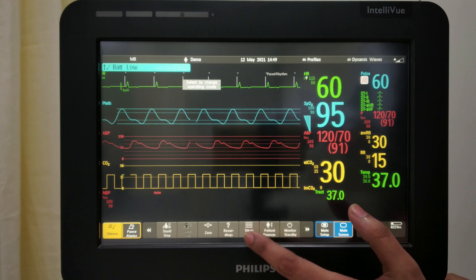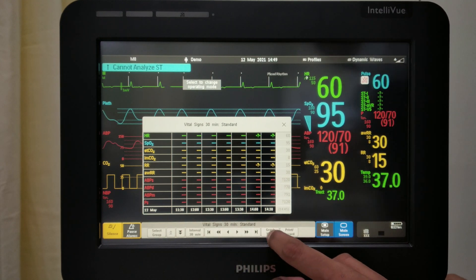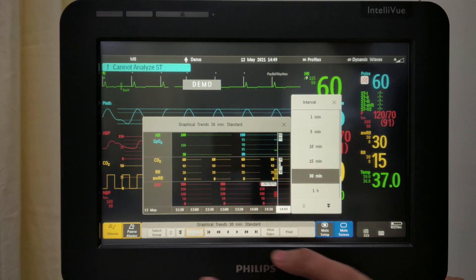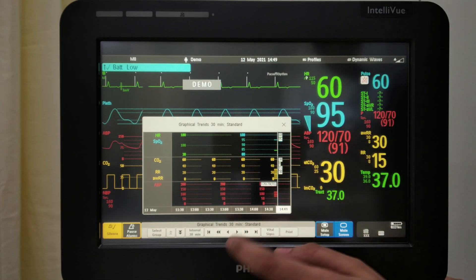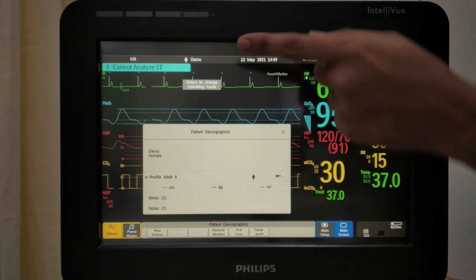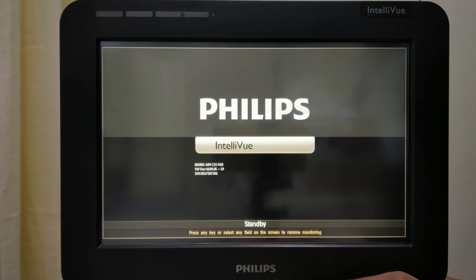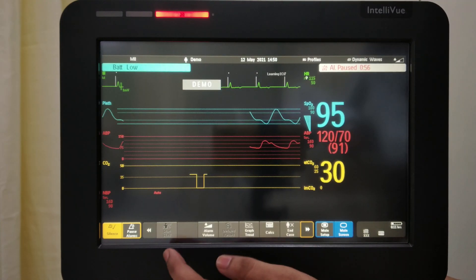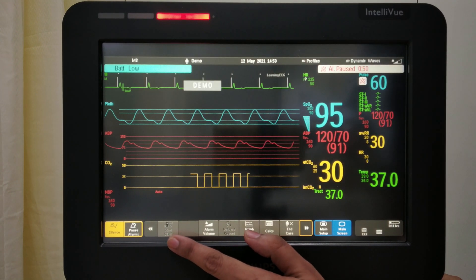Then there are trends — trends are basically the historical details of the patient. You can see the time and also view the graph trend. You can change the interval, for example 1 hour or 15 minutes. Patient demographics — you can admit a patient from here as well. Then there is monitor standby to come back to the screen. The double arrow will show further data. Start STAT is for your NIBP start/stop.